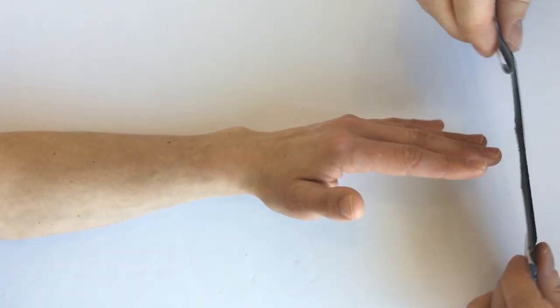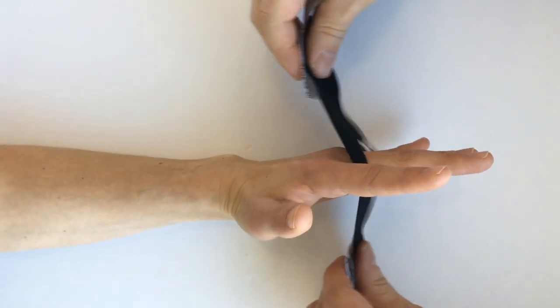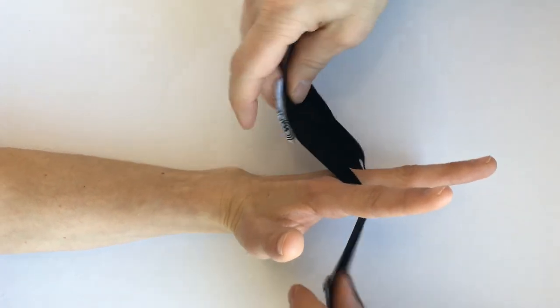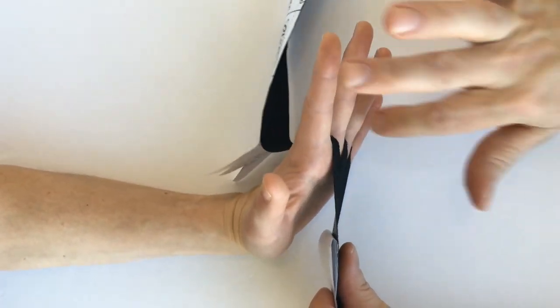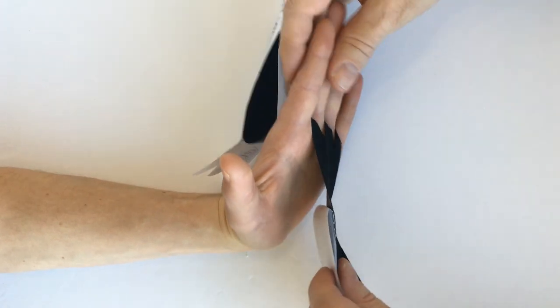You get those little holes right over there, and that gives you a nice piece of kinesio tape in between each of the fingers and the web spaces.